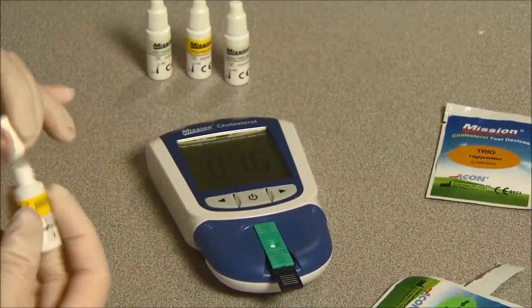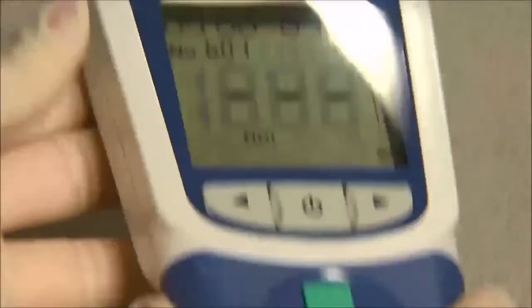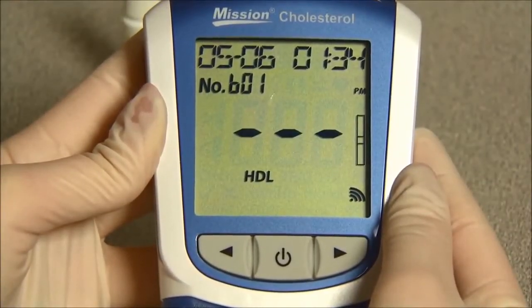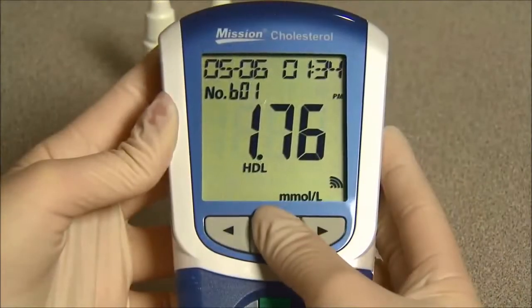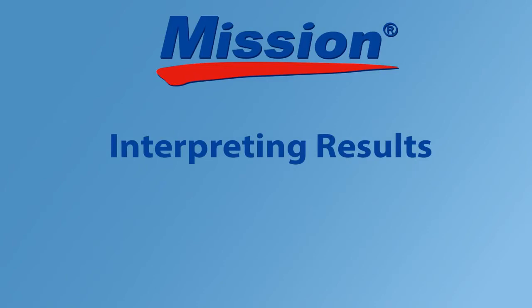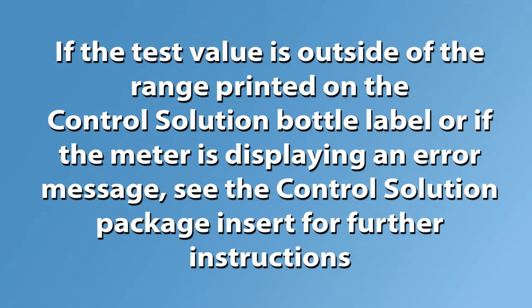Use a 35 µL tip for the 3-in-1 test device and a 10 µL tip for the individual test device. Refer to the Control Solution Packaging Insert for details. Three dashed lines will appear on the meter to show the test is in progress. Read the results on the screen in 2 minutes. The meter will automatically turn off after 5 minutes of inactivity or when the power button is pressed. If the result is within the range printed on the Mission Cholesterol Control Solution bottle label, the meter and test device are performing properly. If the test value is outside of the range or the meter displays an error message, see the Control Solution Package Insert for further instructions. Please contact your local distributor for additional information.